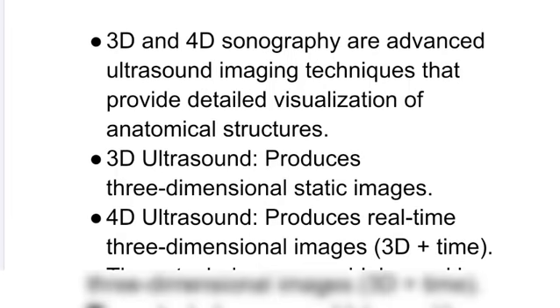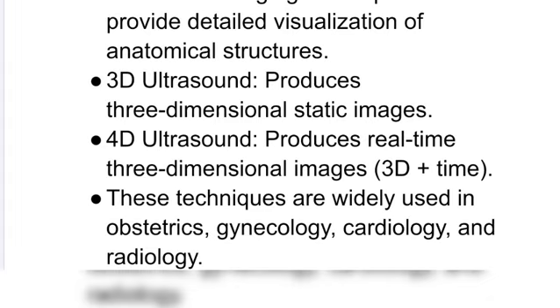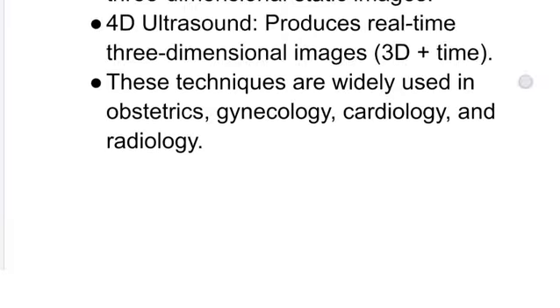First, what is 3D ultrasound? 3D ultrasound produces three-dimensional static images of the anatomical structures. Then what about 4D ultrasound? 4D ultrasound produces real-time 3D images, that is 3D plus time. These techniques are widely used in obstetrics, gynecology, cardiology, and radiology.